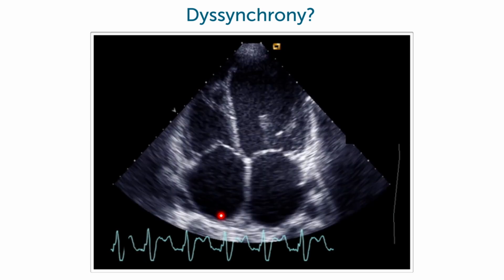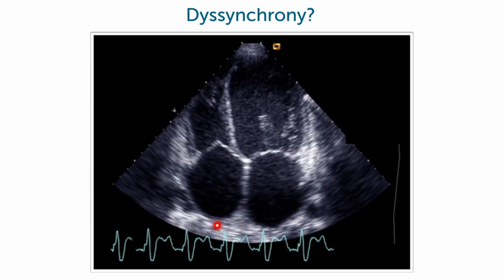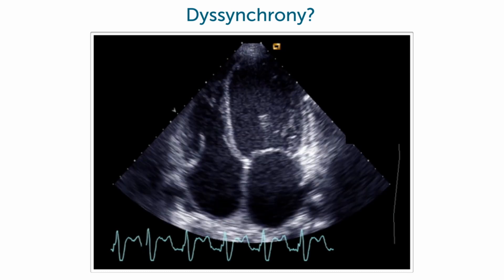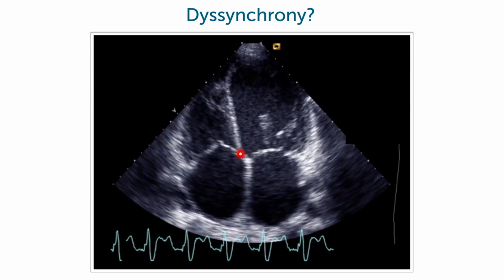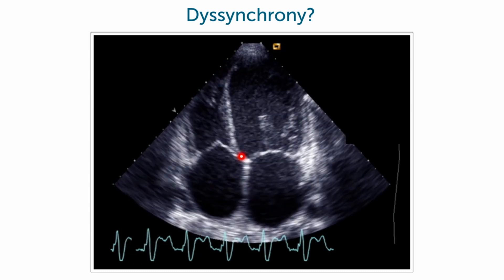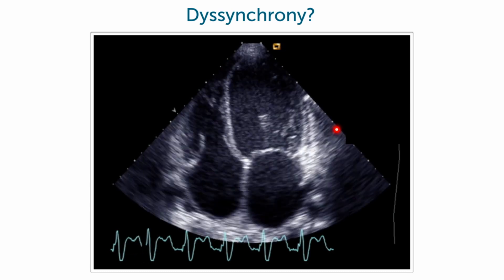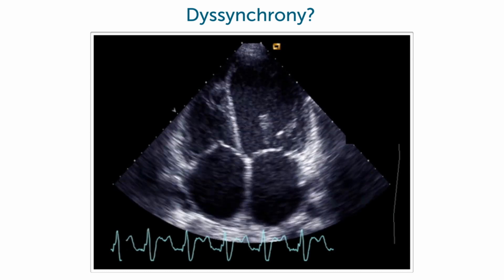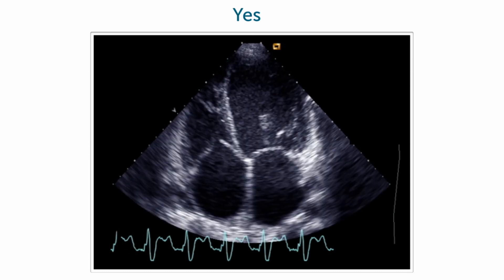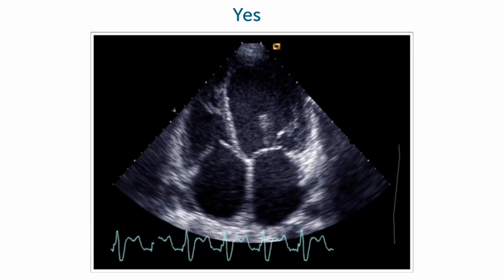The giveaway would be the ECG, but don't focus on that right now. Really look at the septum and compare it with the lateral wall. Yes, this is dyssynchrony as well.